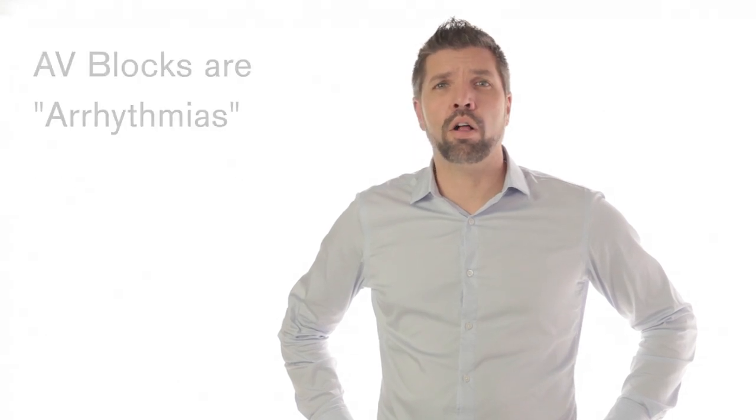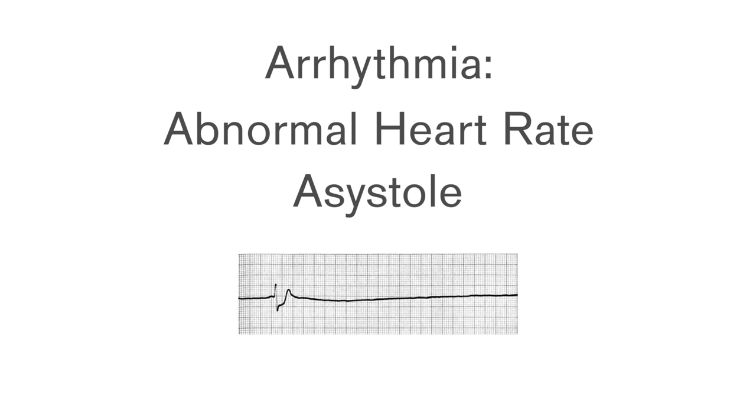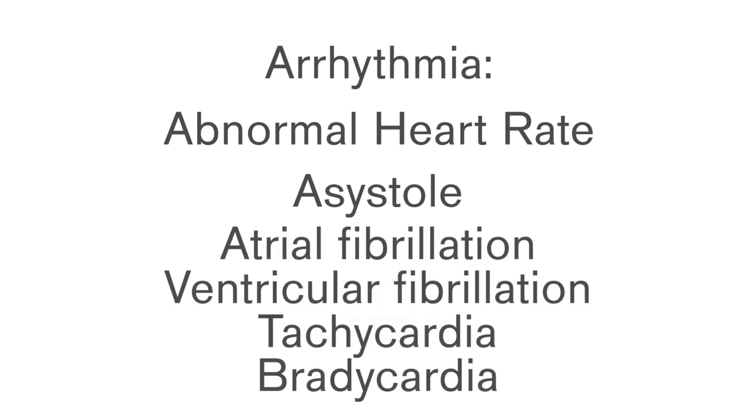These blocks are all called arrhythmias. An abnormal rhythm is what is called an arrhythmia. Some are harmless, but some are lethal. The best known is asystole, an absence of pulsation. As seen in many movies, when a patient dies, it is easy to recognize with a flat line. Some other arrhythmias are atrial fibrillation, ventricular fibrillation, tachycardia, bradycardia, etc.